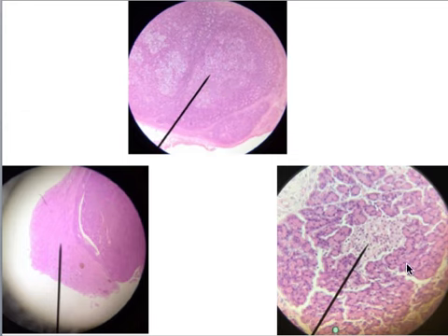Over here is the slide of the pancreas. These darker cells are the acinar cells. Those are the cells for the digestive system. And this lighter cluster of cells is the pancreatic islet that is made up of those alpha and beta cells that are going to make the glucagon and insulin.